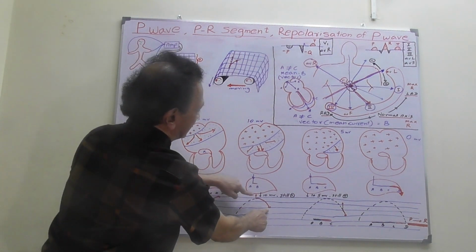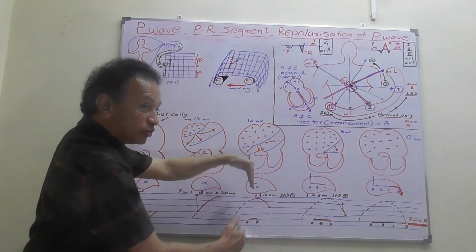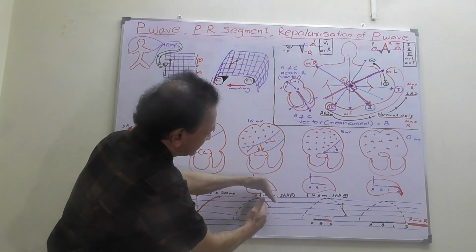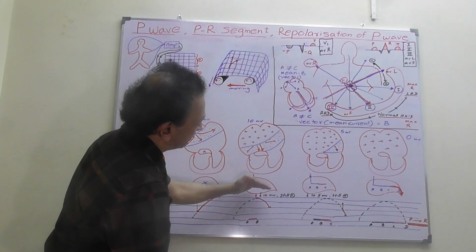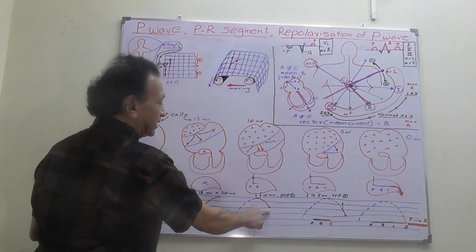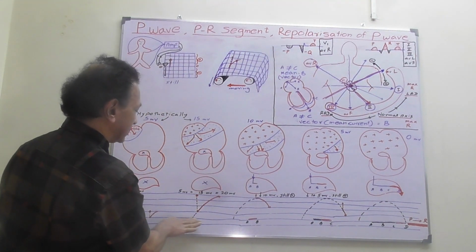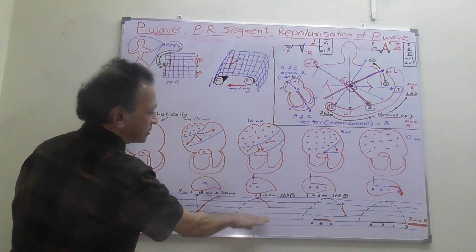And as the ECG tracing is moving, rather than going downwards, it tends to get bended. So it will produce a bended current towards this side, coming down. Though it is coming down, it is not a negative current, it is situated above the zero line, the horizontal isoelectric line.